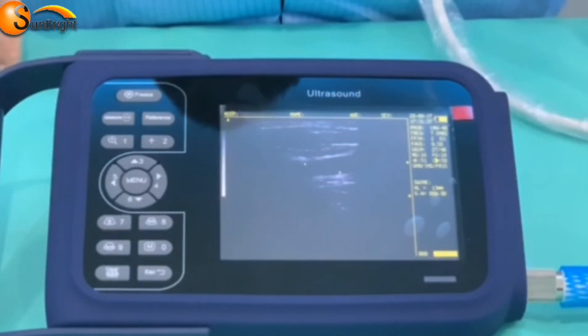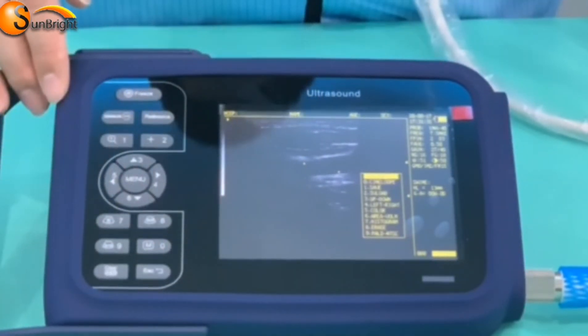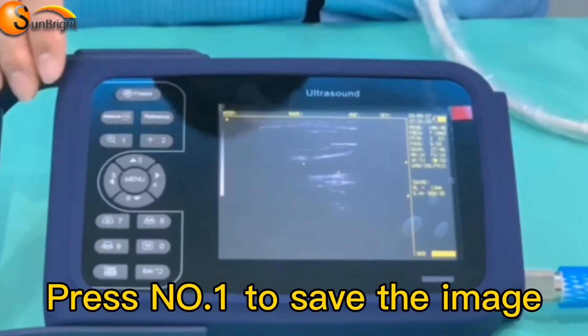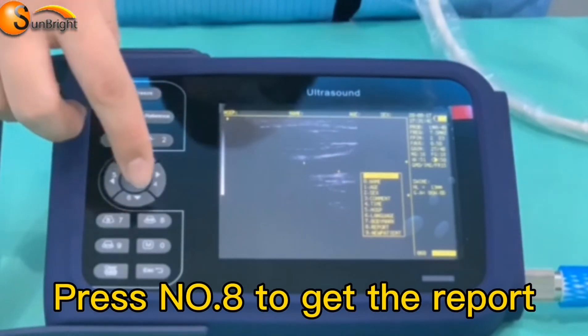After measurement, press the M key, then press number one to save the image. Press Menu, then press number eight to get the report.